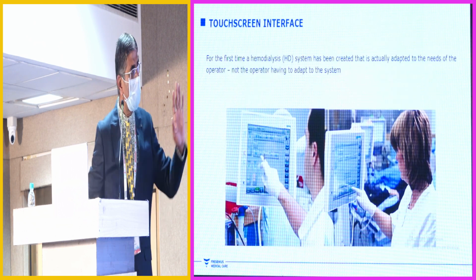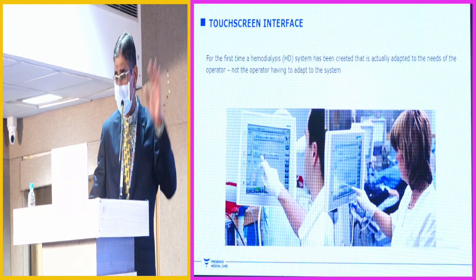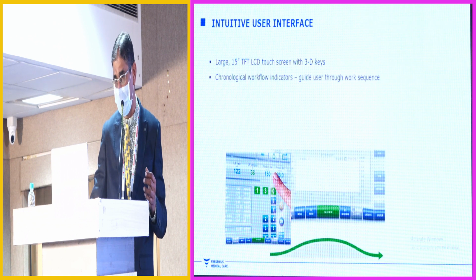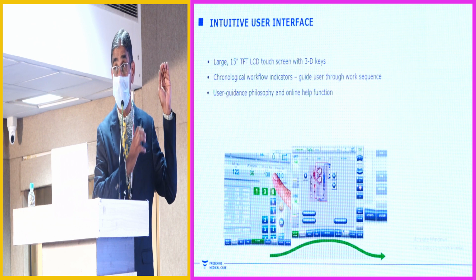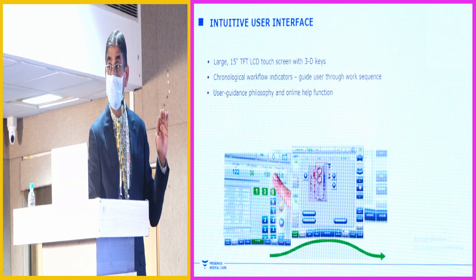It's basically a touch screen. To me, it's just a gimmick. It doesn't enhance anything or help in terms of the adequacy of dialysis or clearance. So you have a workflow in chronological order. That means a healthcare provider just needs to follow the menu, where you need to go for preparation.